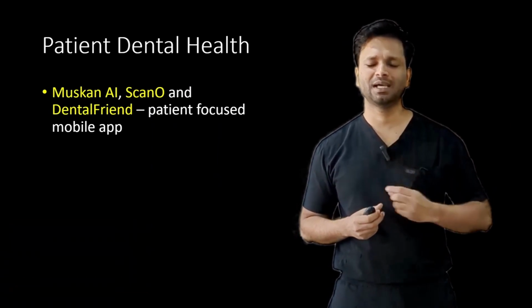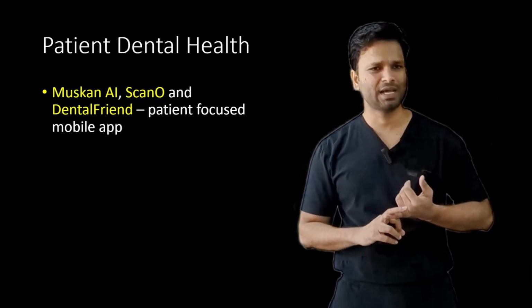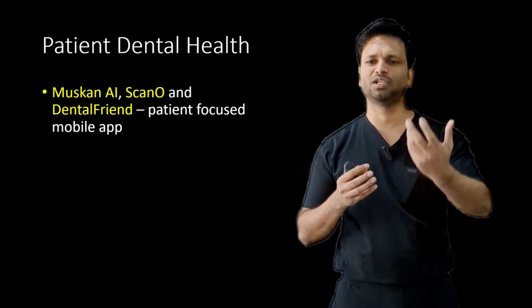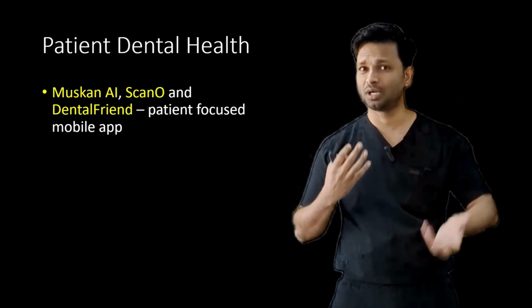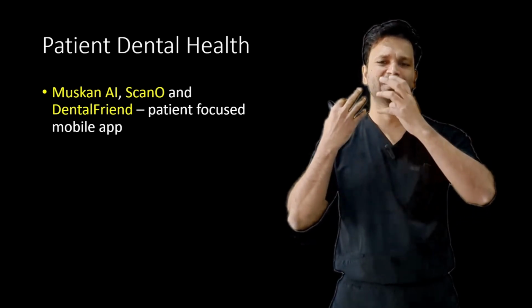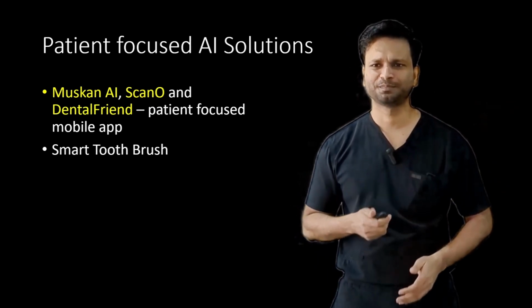Now, patient-facing apps in India are, as I told you earlier, Muskan AI, ScanO, and Dental Friend. These are all the apps. Basically, you have to install these apps on your phone, and you can click the picture of your oral cavity, your teeth, and it can tell you whether you need cleaning, whether there's a lesion in your oral cavity. So it can scan your oral cavity for your oral health.